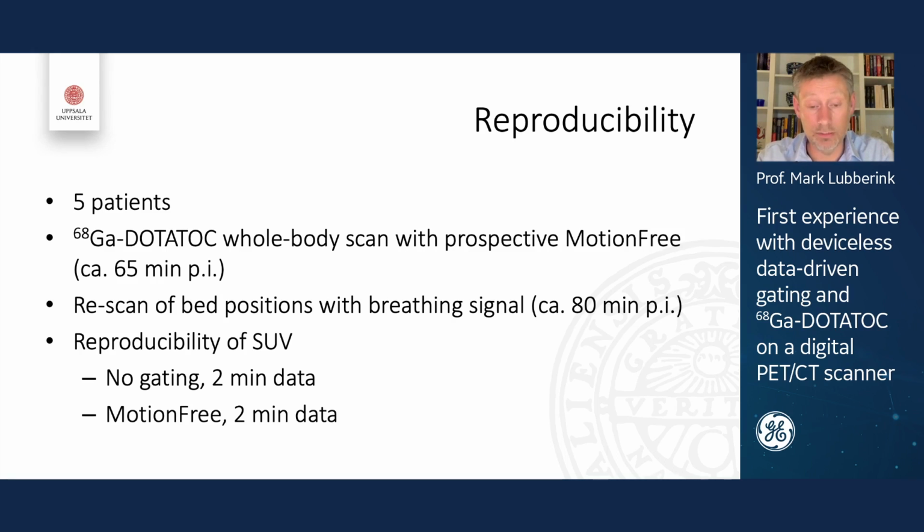So that started after about 80 minutes after injection. And we looked at the SUV values during both scans, both without gating and using MotionFree. And in both cases, we used 2 minutes of the available data.